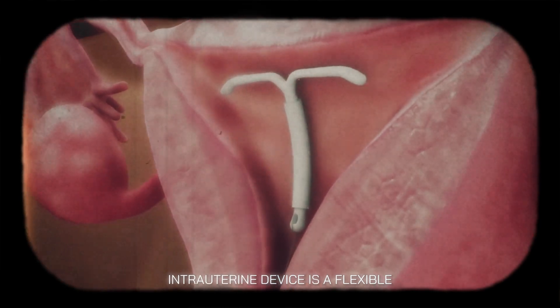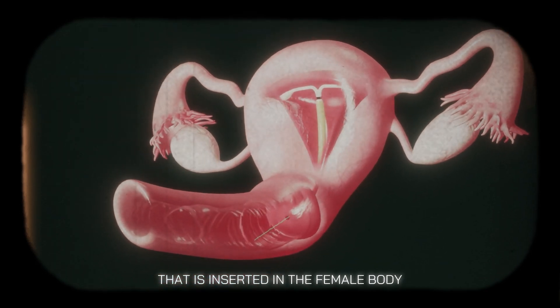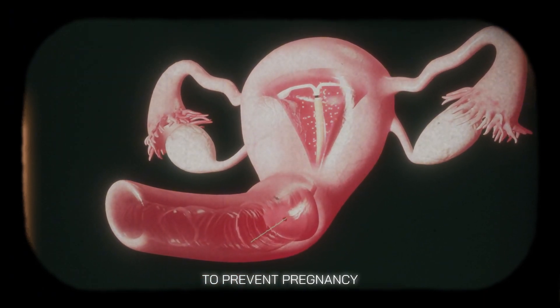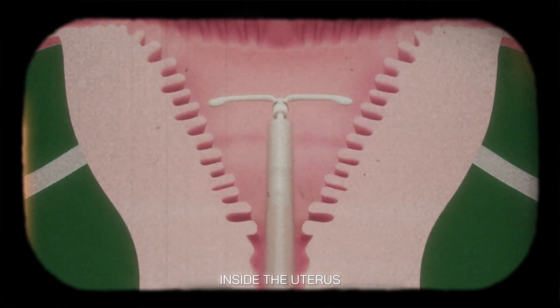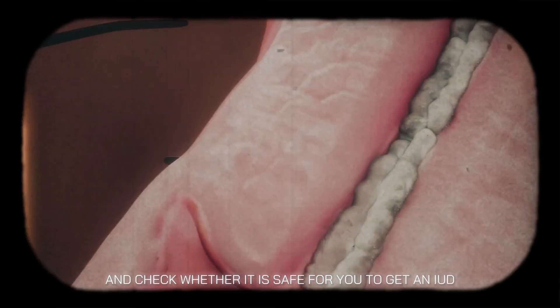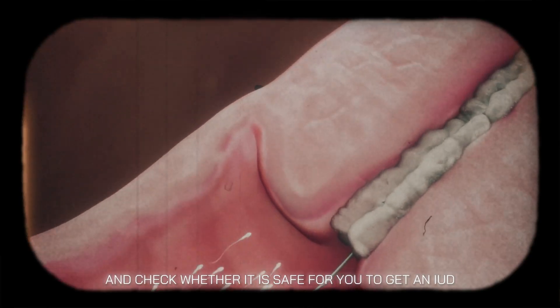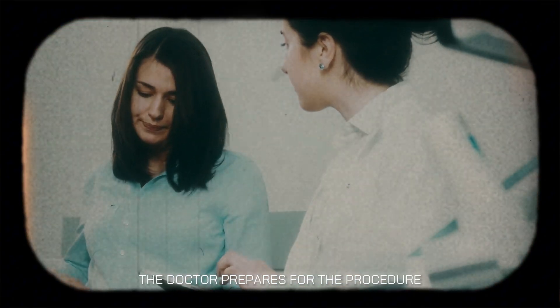An intrauterine device is a flexible T-shaped elastic device that is inserted in the female body to prevent pregnancy. This device is placed at a specific place inside the uterus. To begin, the doctor reviews the long-term contraceptive history and checks whether it is safe for you to get an IUD or not. If everything is fine, the doctor prepares for the procedure.